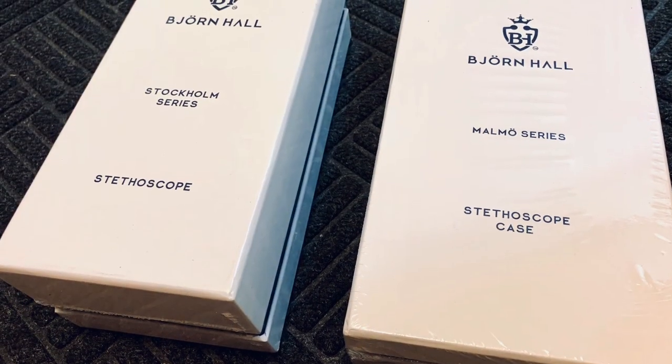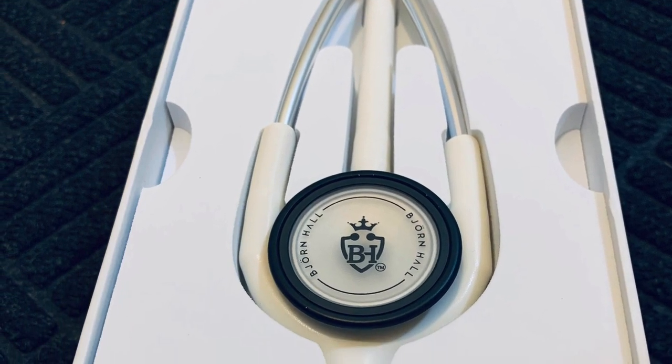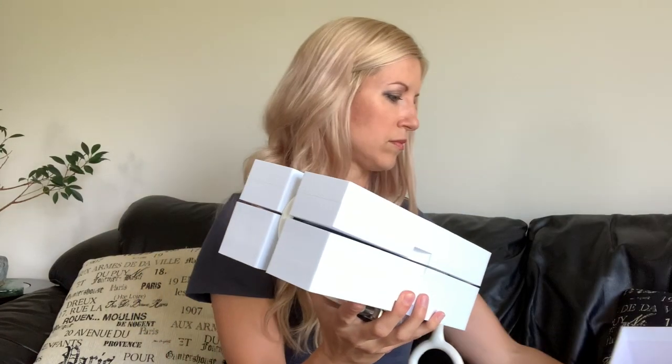First of all, it arrives in this beautiful packaging — it looks like a fine jewelry box. I've already had it out of the box but I put it back so you could see how well it's packaged and how beautifully it arrives. This is how it looks when you open it, and it arrived in plastic wrap as well. I chose white because I love white — you rarely see a white stethoscope. I've always had a black stethoscope and this is just such a nice refreshing change.